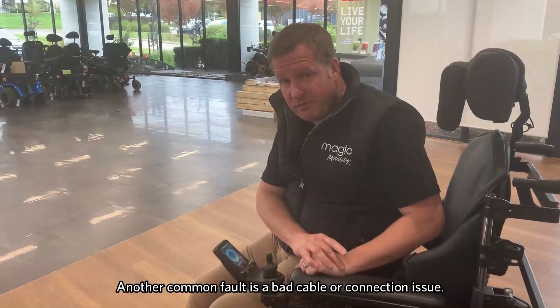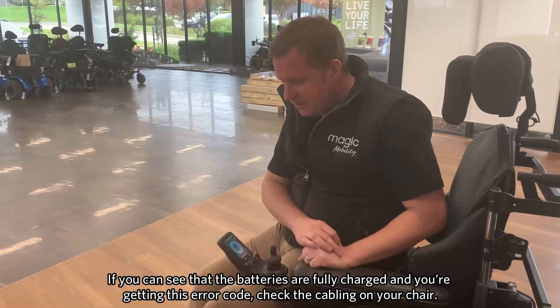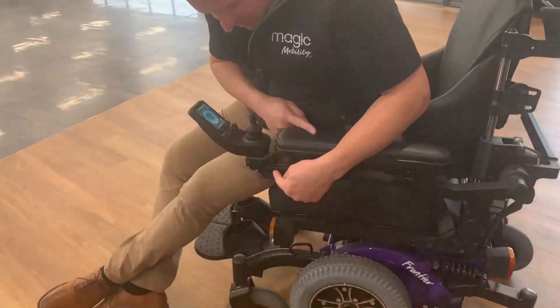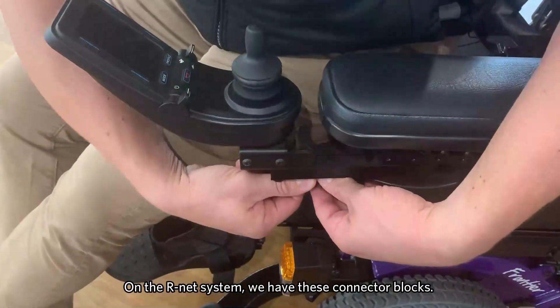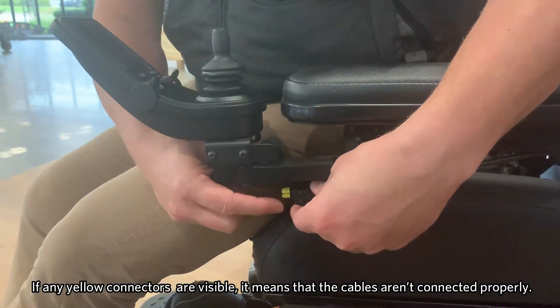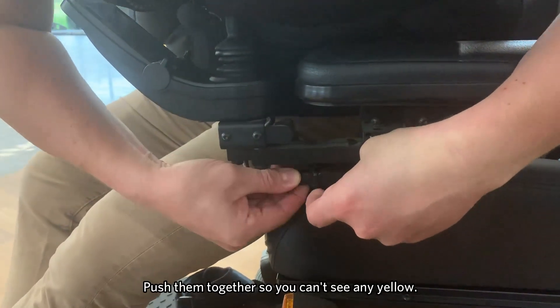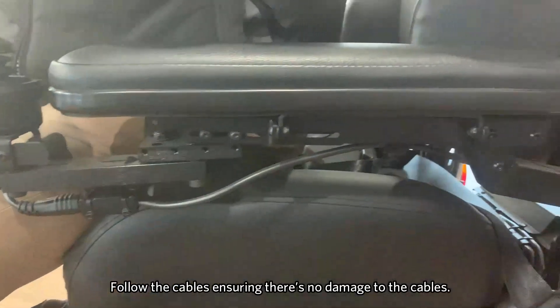One of the other common faults you might find with your joystick is a bad cable or a connection issue. If you can see that the batteries are fully charged and for some reason the chair is not driving and you're getting this error code, I would just run down and follow the cabling of your chair. On the R-Net system, we have these connector blocks — you can see that the connector blocks have this yellow cabling or yellow connection. If you can see any of the yellow connectors, it means that the cables aren't pushed home properly. Ensure that they're pushed into place so you can't see any yellow, and then follow the cables and make sure there's no damage to any of the cables as well.